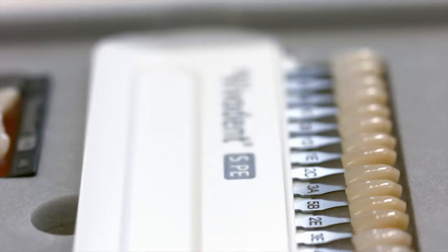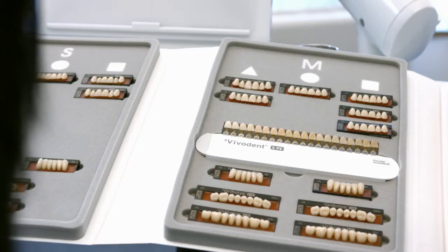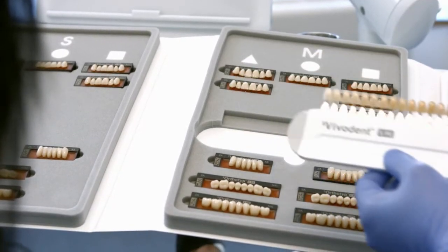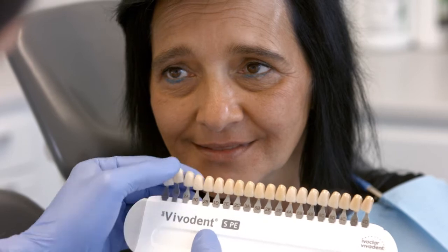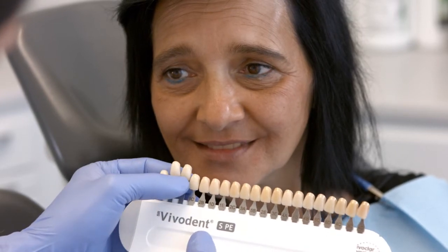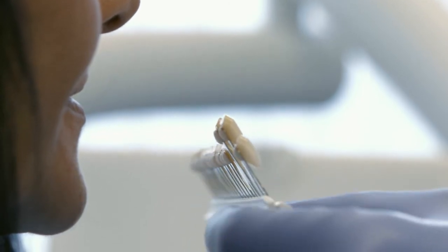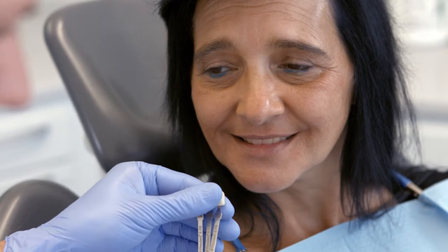Select the tooth shade on your patient under defined light conditions at a color temperature of 5,500 degrees Kelvin or under daylight. The sample teeth of the SR Vivodent SPE Shade Guide feature the same layering structure and material as the original SR Vivodent SPE molds. This results in fewer and less severe shade deviations.